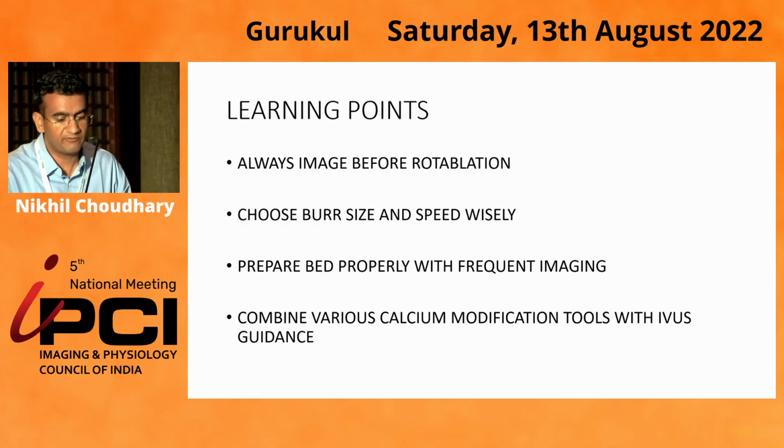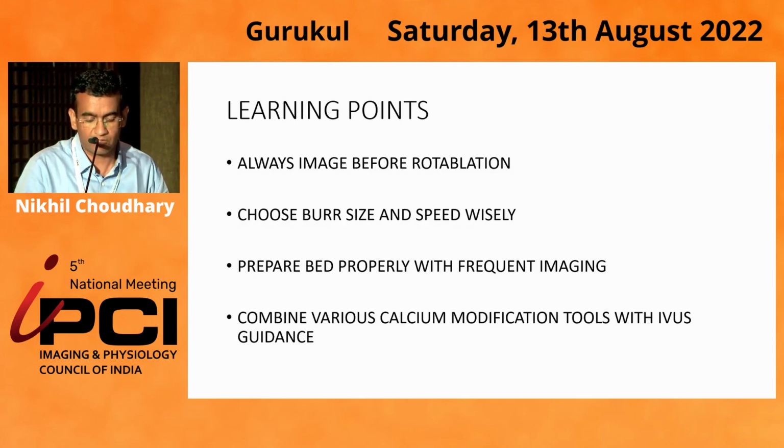So the learning points here for me were: always image before and after rotablation and after every step. Choose the burr size and speed wisely, and of course, do a lot of imaging and prepare the bed properly before you put in the stent. And a lot of times, use a lot of calcium modification tools, whichever are at your disposal.